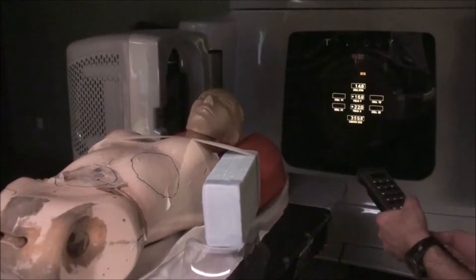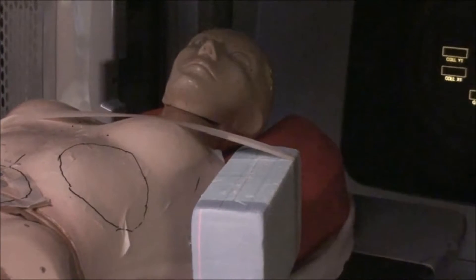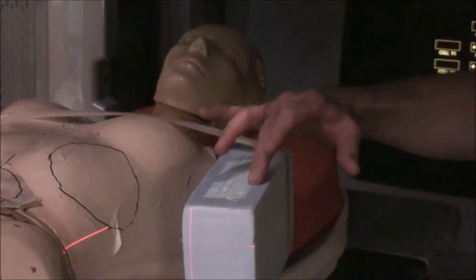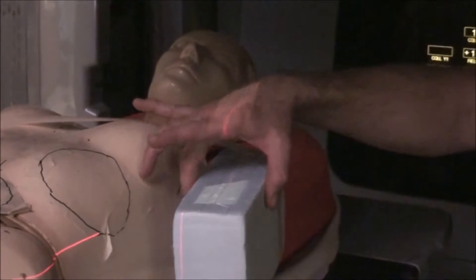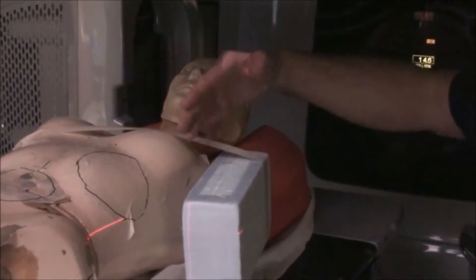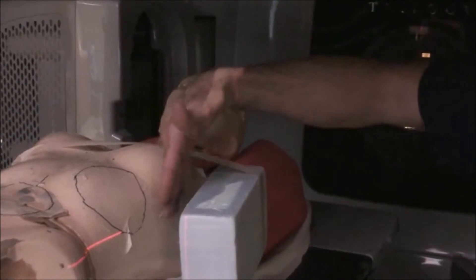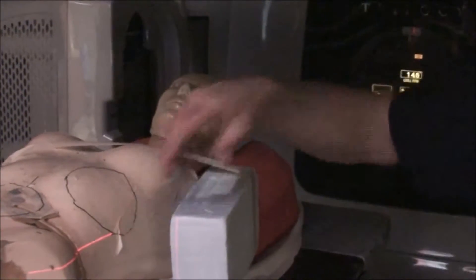You want to set the field size such that the width is just wide enough to encompass the bone, but have channels running down each side so that you're not treating the entire width of this extremity. You want to just treat the bony area and leave lymphatic flow on the laterals — on the inside and the outside. Also, if you make your field as narrow as you can reproducibly, you're going to have less chance of treating the axilla or the lung as well.